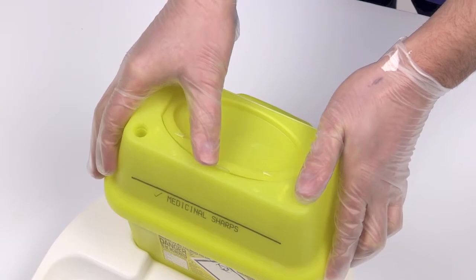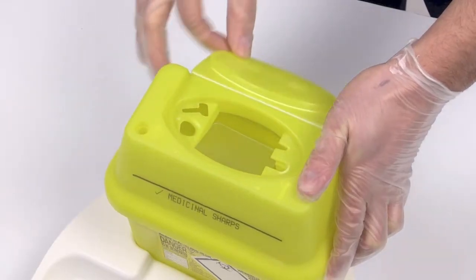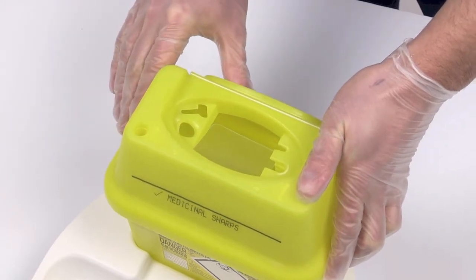To release the temporary closure feature, press down on the tab. Rotate the lid until it engages in the open position. The container is now ready for use.